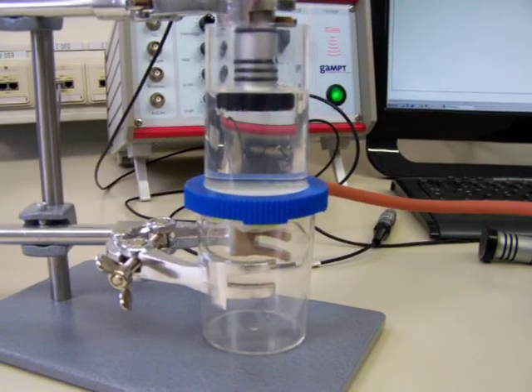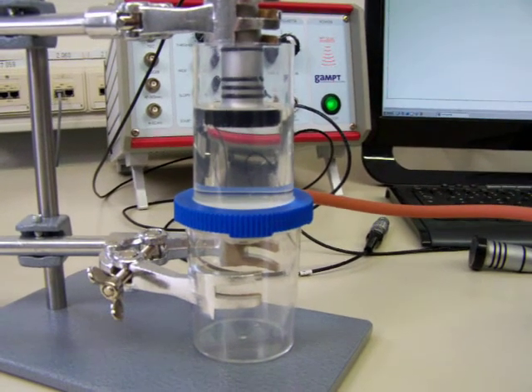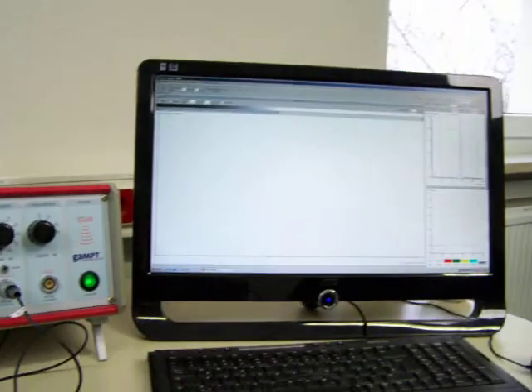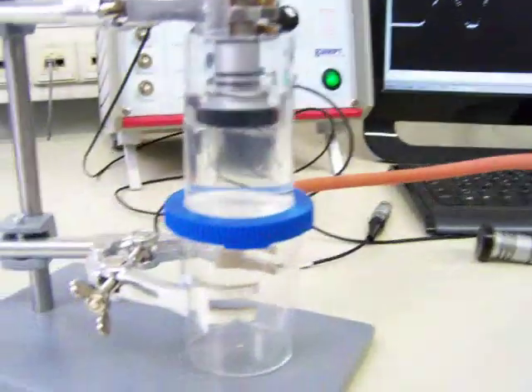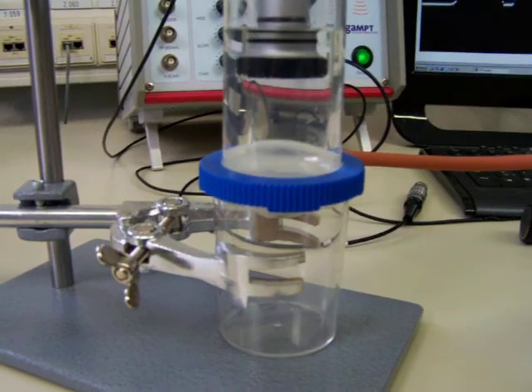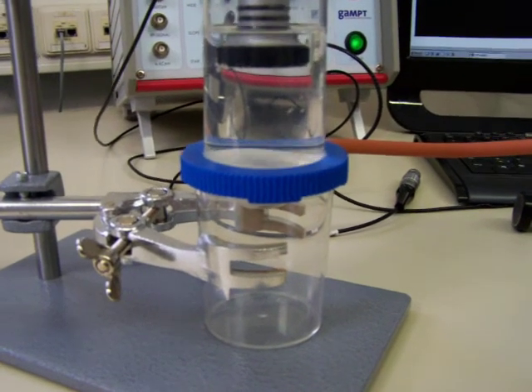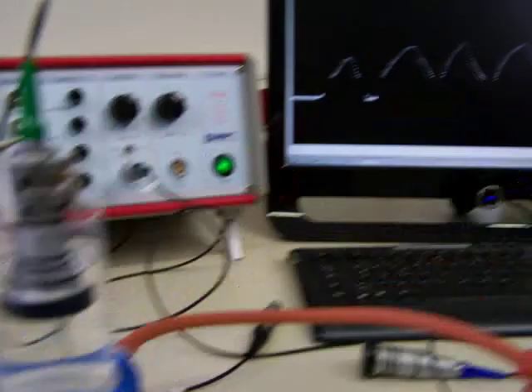If you click in the software on start, our program starts running, and now we put pressure into this membrane. The membrane is moving and the sound will be reflected on the moving membrane, and you see the signal on the screen.